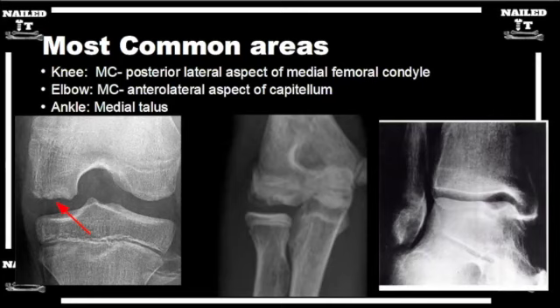And so that flexed view is really important, especially if you're thinking in your mind that this patient might have an OCD lesion and you want to get a really good visualization of that OCD lesion just with your initial imaging in clinic with radiography, with x-rays.